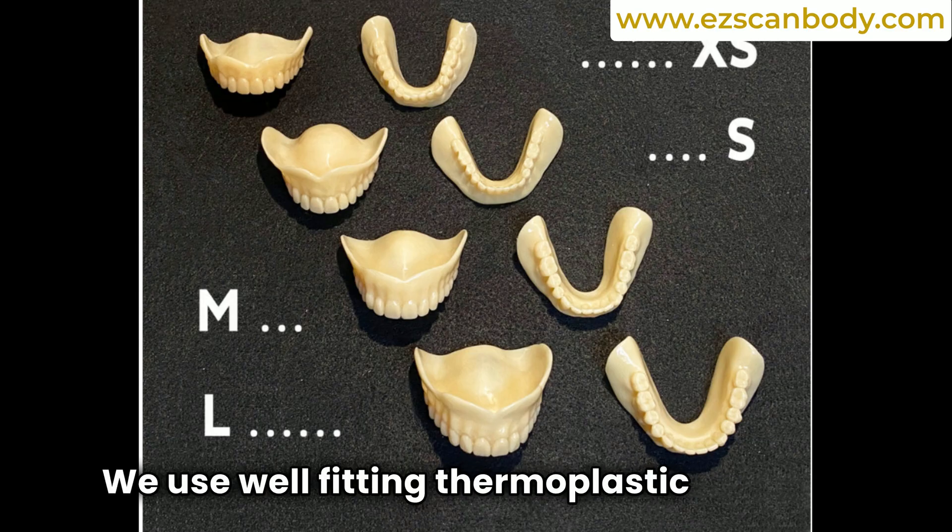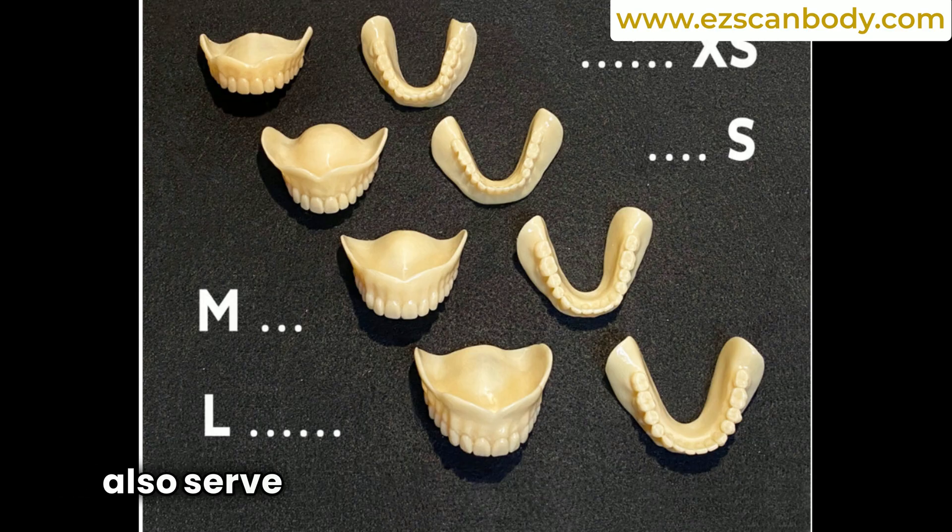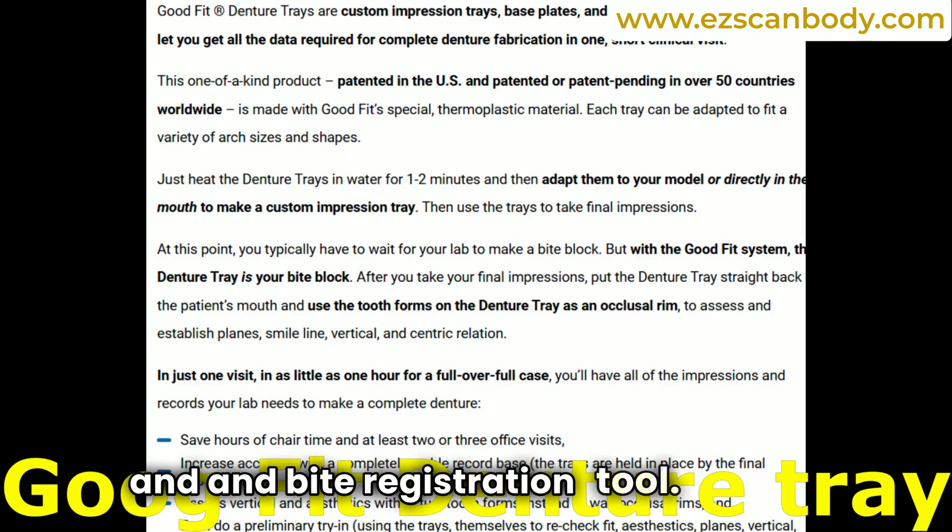We use well-fitting thermoplastic denture-shaped trays, which can also serve as both an impression and bite registration tool.